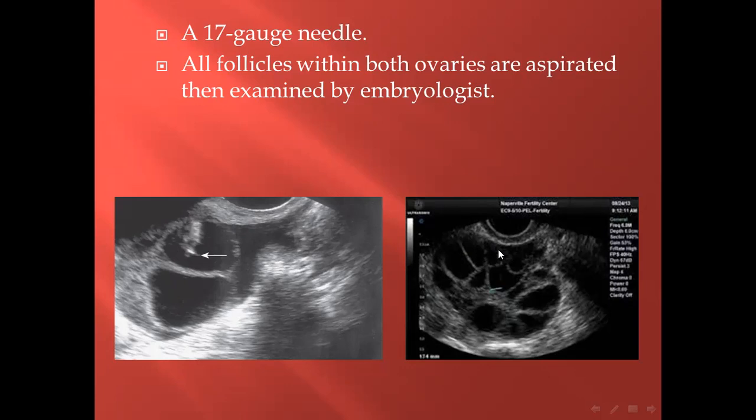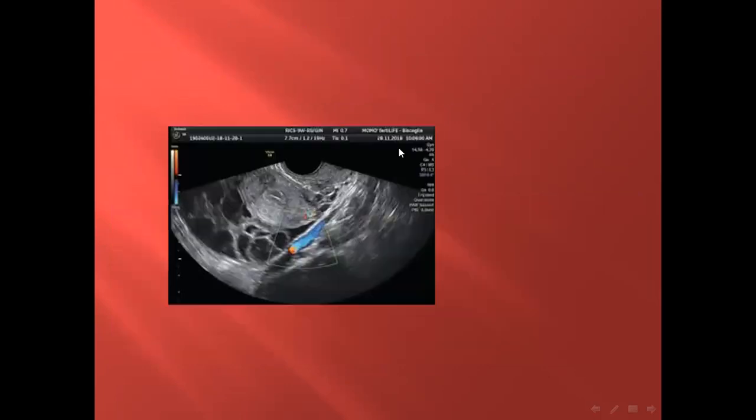The follicle to be aspirated should be in the middle of the screen. This is the picture of the iliac vein, which should be avoided during aspiration, because it may lead to severe or massive hemorrhage.